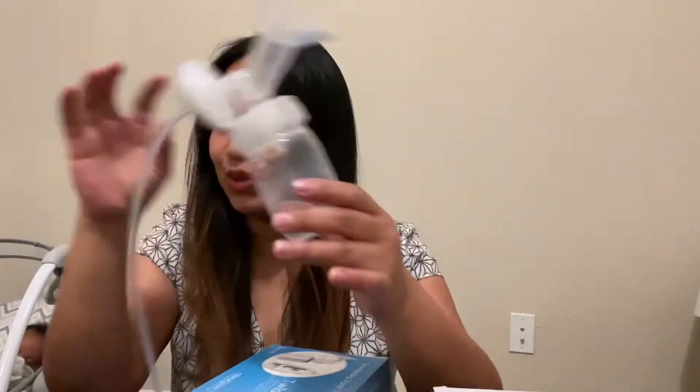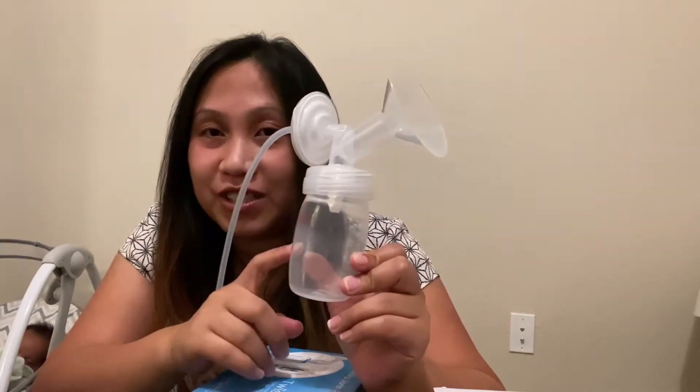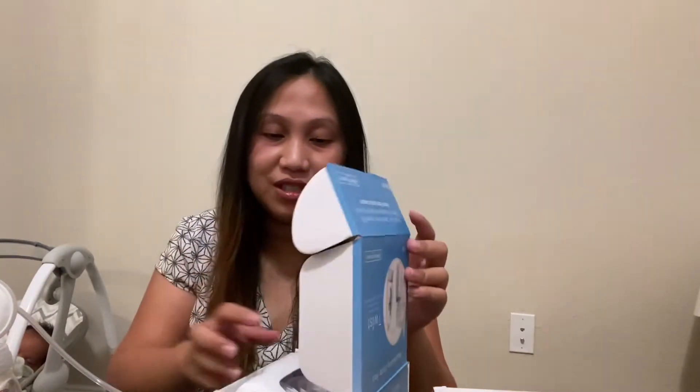Normally with breast pumping you have too many parts to clean, so this is what it looks like. Instead of a bottle, we're going to use this pouch directly, so you can pump directly into the pouch and then after you're done, just put it in the freezer. Let me show you how easy it is.